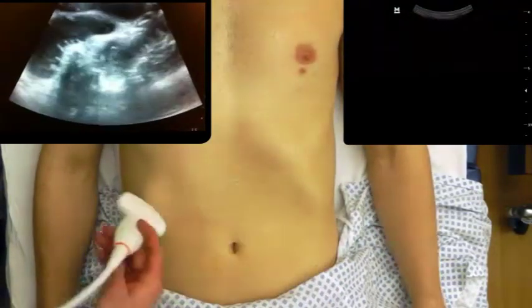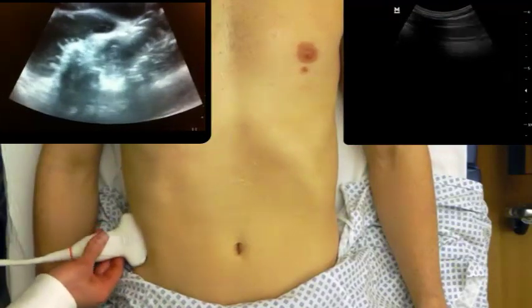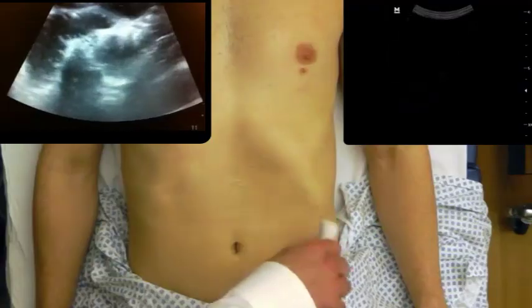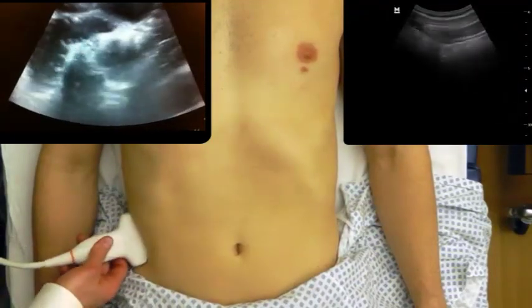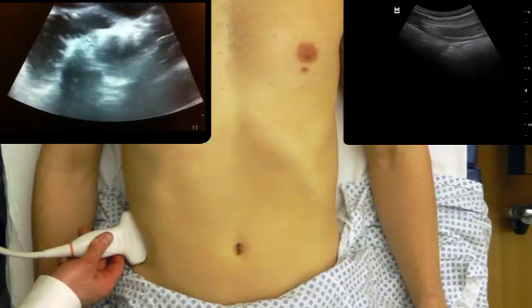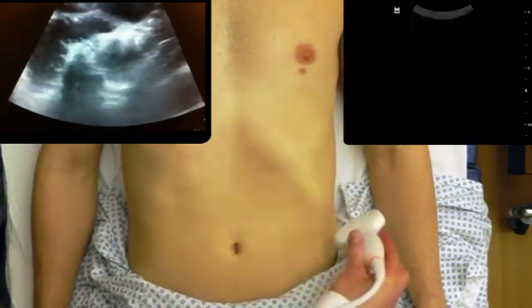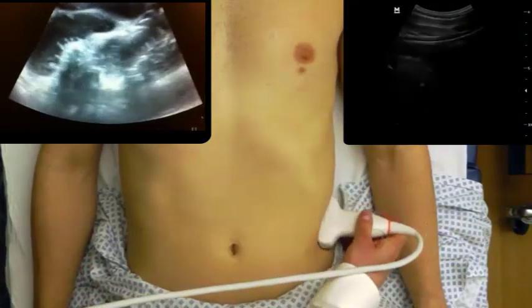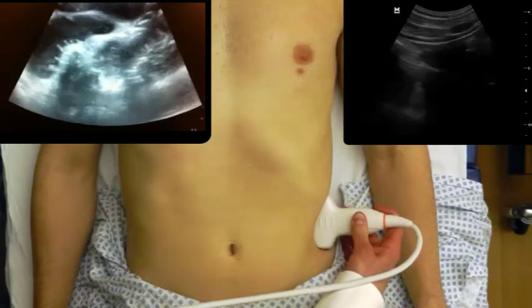After looking anteriorly, I'm going to look somewhat posteriorly on the patient's abdomen to make sure that there's not air in those anterior loops that can be obstructing my view. I'll look on both the right and the left sides posteriorly, looking for fluid-filled loops of bowel.